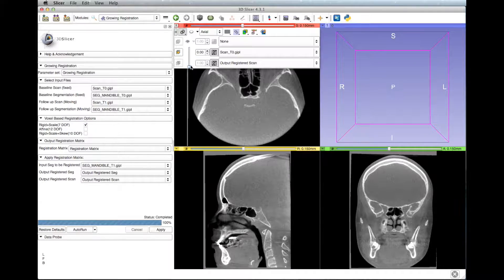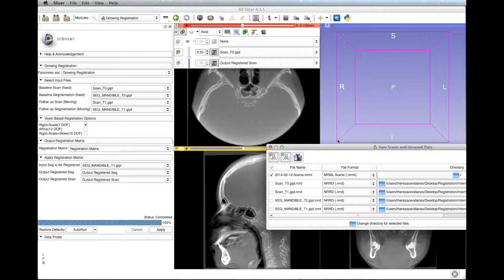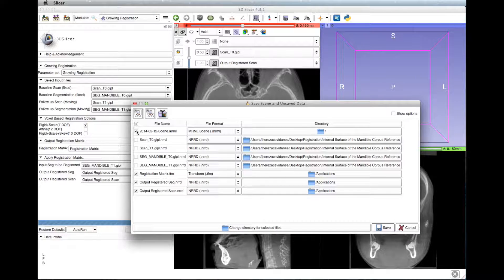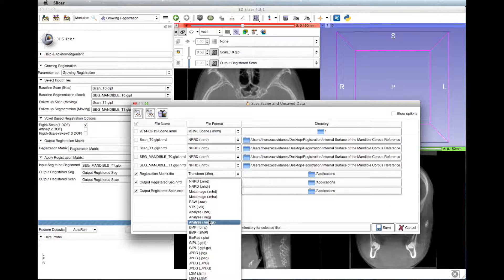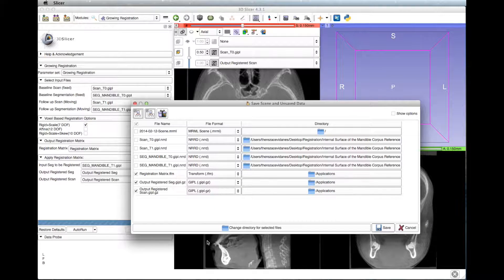Don't forget to save the files by clicking the save button in the upper left corner. Save the output registered scan, output registered segmentation, and registration matrix. Change the names if needed, the file formats, and directories.